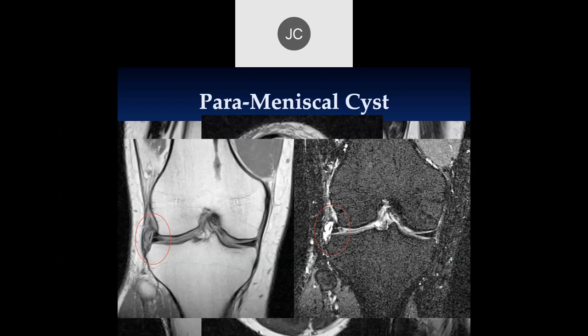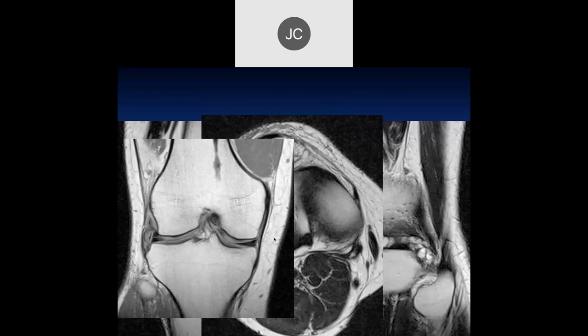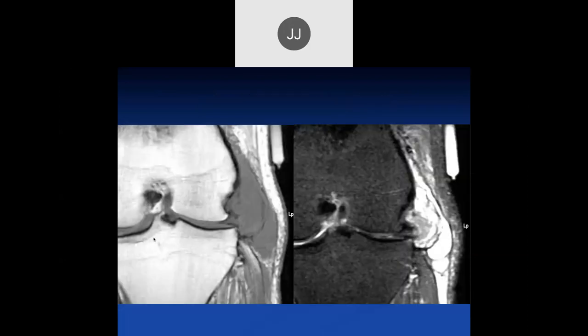And that's really the source of the cyst here. And you can see the actual tear itself looks pretty small. Yeah, tears are small, but that's why you get the cyst. If it was large, you just get a bunch of fluid inside the knee and outside the knee.